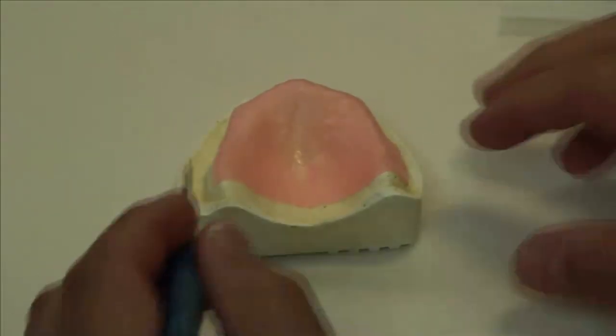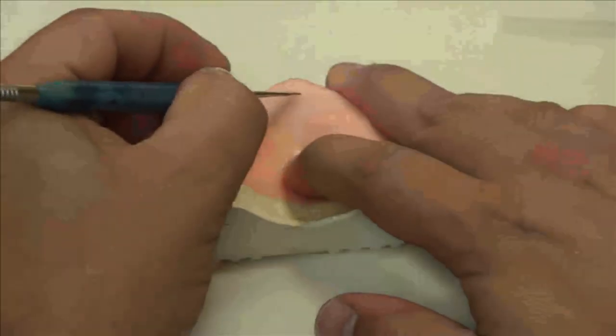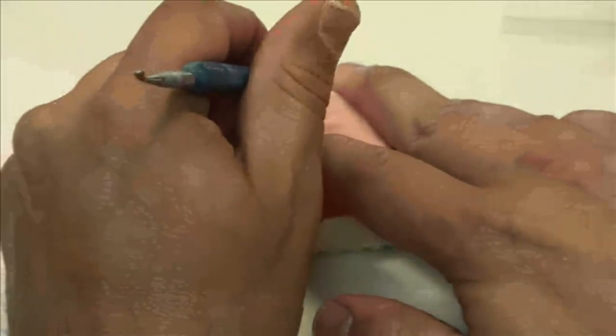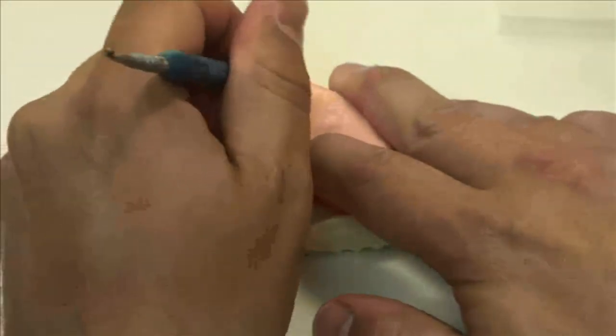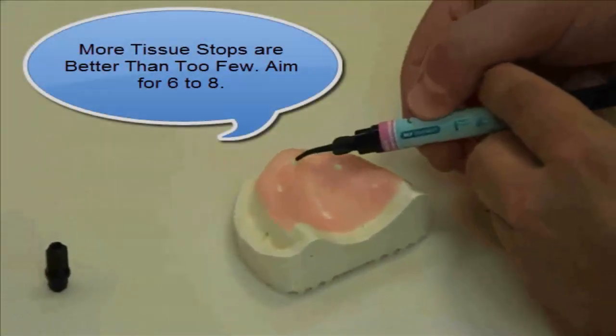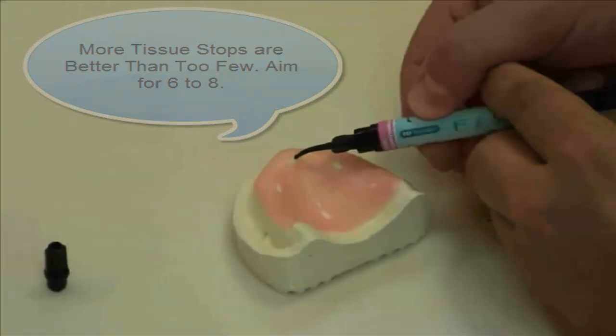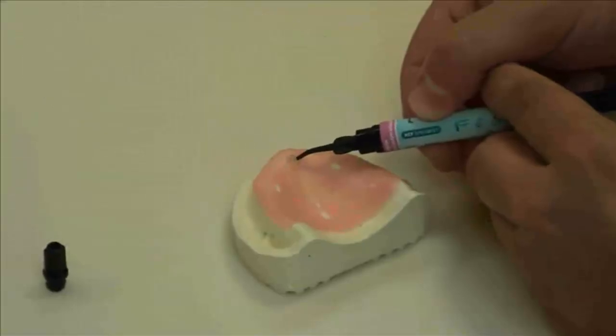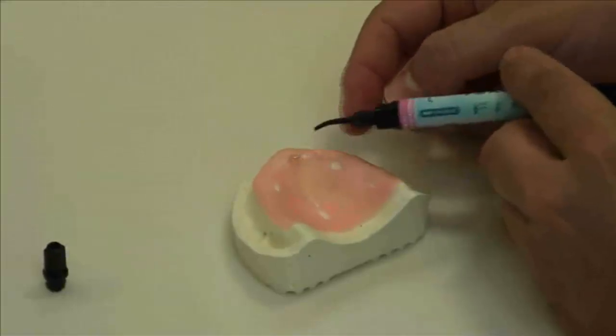The first step in creating tissue stops is to cut rectangular holes into the wax spacer. Place the holes where you would like the tissue support to be in the framework. Using the FiberForce pink light cure resin, fill the holes in the spacer, overfilling only slightly.